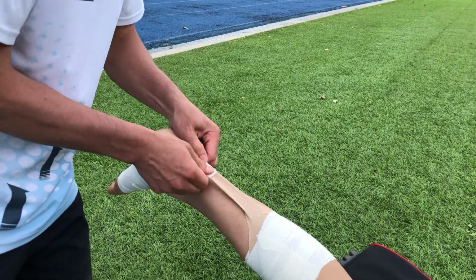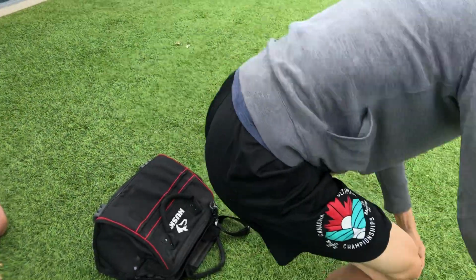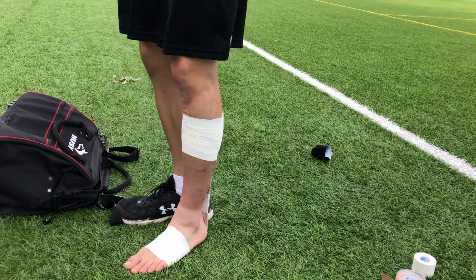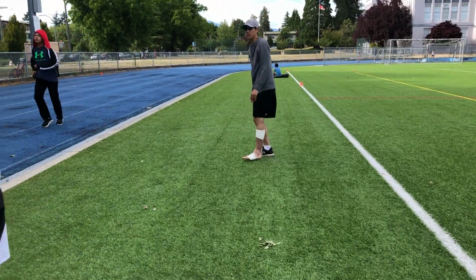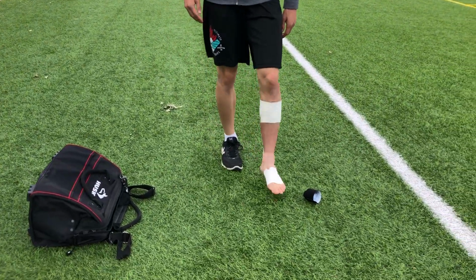Just like that. Okay, so you can stand up. Try putting some pressure on it. It's going to stretch out a little bit as you get moving, but just try walking first. We can see it's pretty tight and it's affecting his dorsiflexion range of motion a little bit. There's a lot of stiffness there.